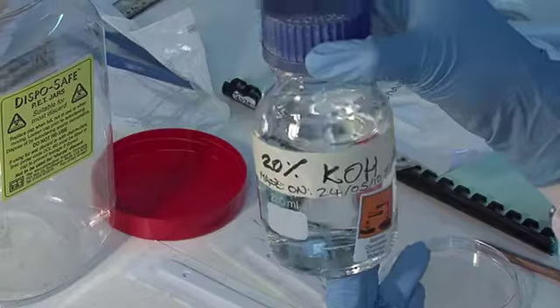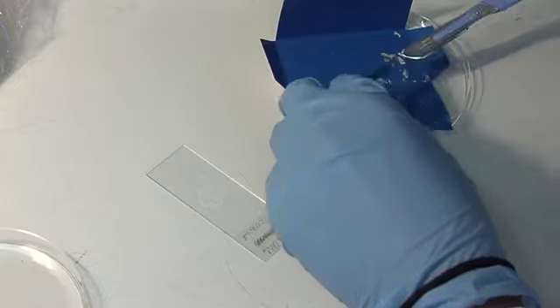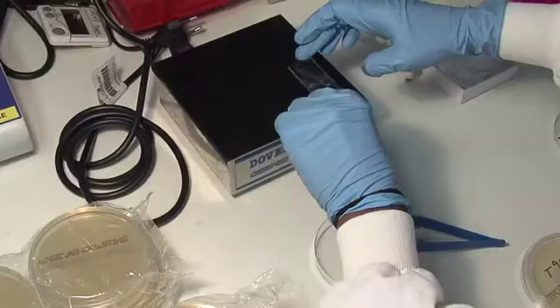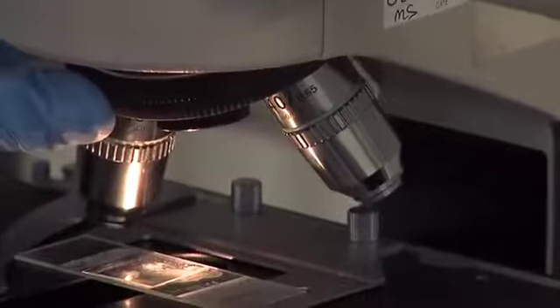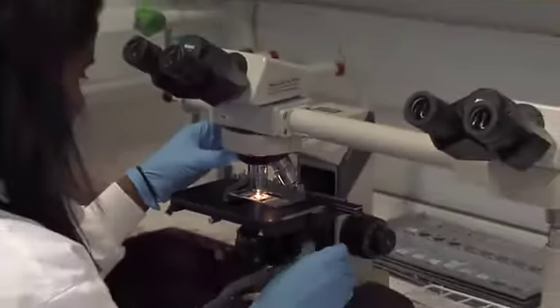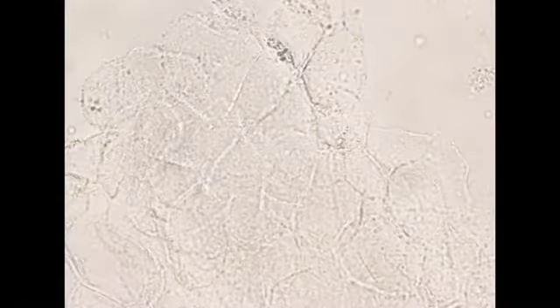Direct microscopy is performed using 20% potassium hydroxide on a slide, and fragments of the nail are added to the potassium hydroxide. A cover slip is applied and the slide heated on a hot plate for approximately 15 minutes to allow digestion and clearing of the keratin and skin cells by the potassium hydroxide. After digestion, the slide is examined under a microscope using the ×40 objective. Fungal elements are seen as branching hyphae running across the outside of the skin cells, as can be seen in this slide.